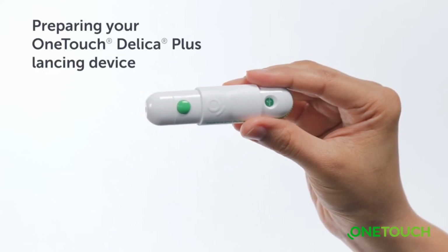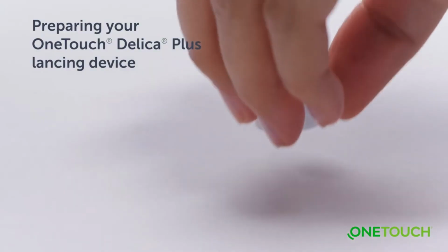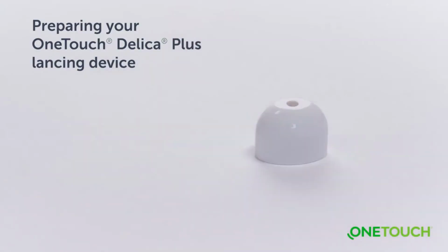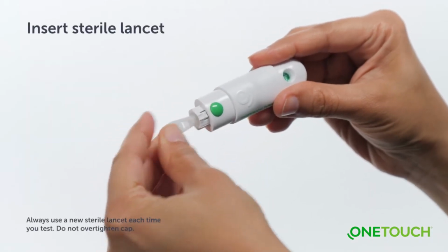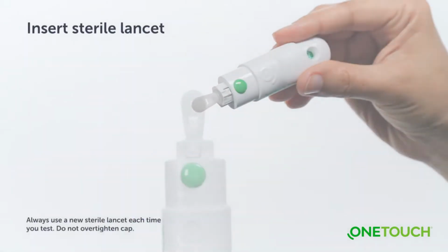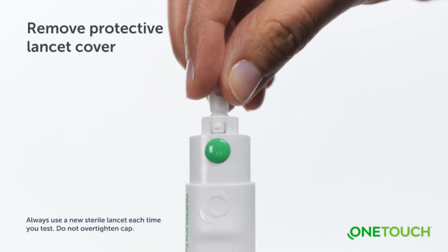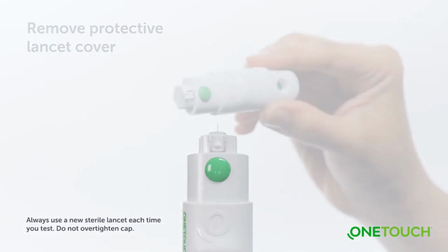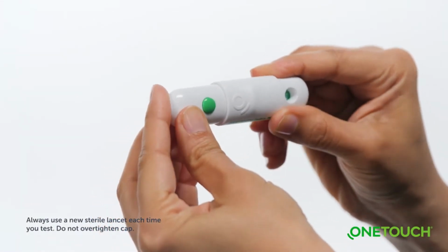This is the OneTouch Delica Plus lancing device. It uses precision guidance technology to reduce vibration for smoother lancing. First, we need to prepare the device with a new sterile lancet. You should always use a new sterile lancet, as this will help prevent infection and reduce pain. Save the lancet cap for later, as you will need it for safe lancet removal and disposal.